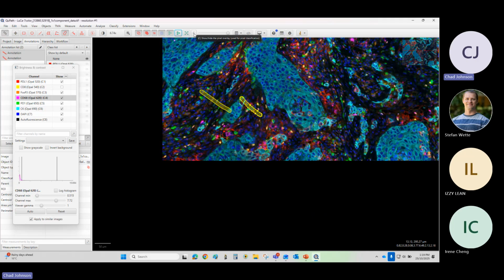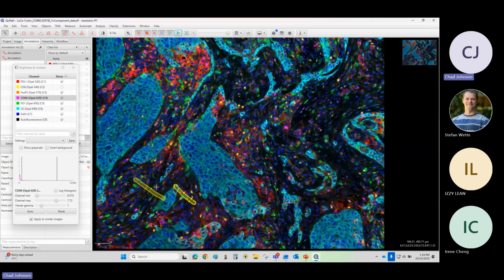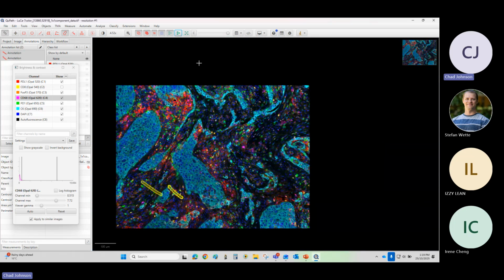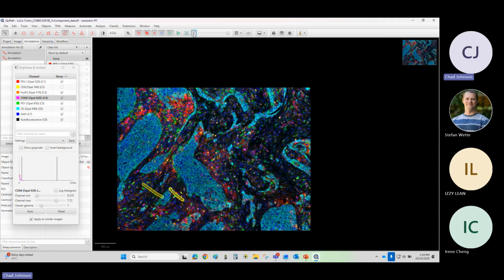This C button is really good for pixel overlays. This is when we start to train the model and use thresholds and things like that. That will allow us to remove it, because when the threshold comes up, it actually just fills in everything. So if we're still training our model, it can get in the way. If you hide it, it allows you to then see the data as it is, and then you can continue to train the model without it being so cluttered.